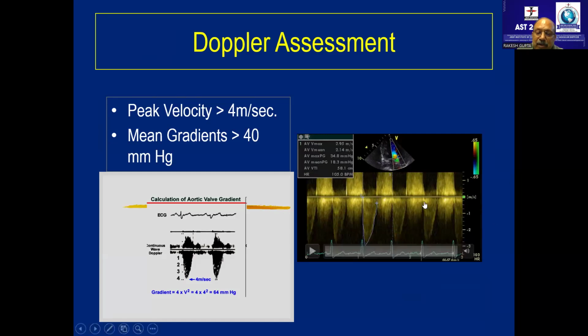So if you have a severe aortic stenosis or aortic stenosis, what will happen? You will not be able to contain the Doppler spectrum pattern despite increasing this scale, moving this baseline up. And that is the time you have to switch on to continuous wave Doppler to contain the Doppler spectrum pattern. Is that clear?